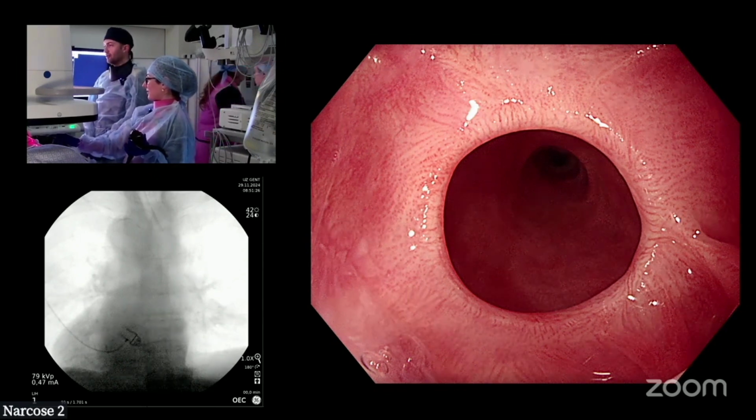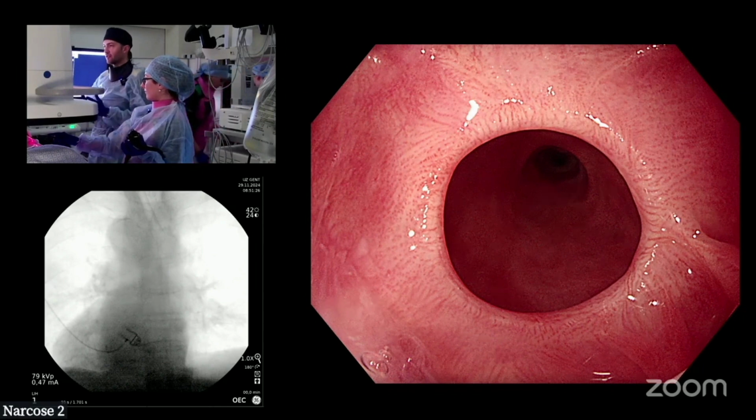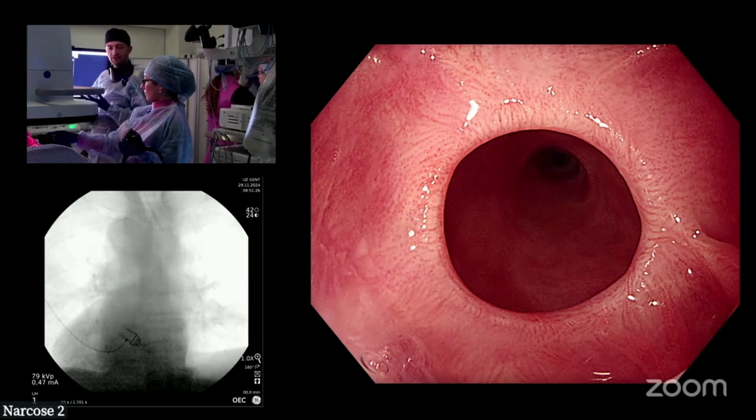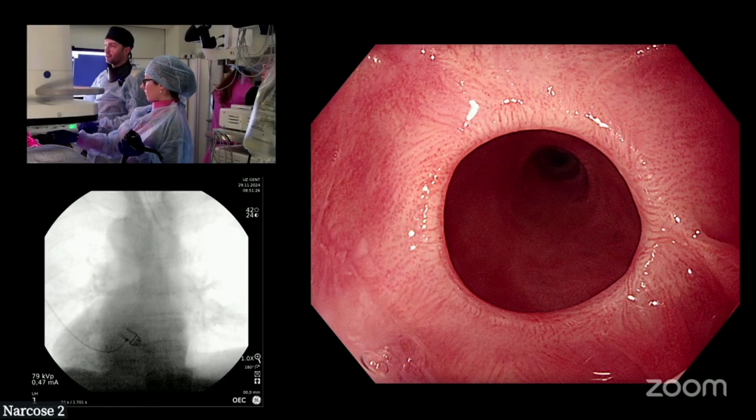So that's important. It starts with assessment of the stenosis. Can I assess it endoscopically? And in this case, you can assess it endoscopically. You can see through it. So therefore, I don't need a nasogastric scope. I don't need fluoroscopy. I can make a decision based on this one endoscopic image that you've frozen, which is fantastic that you did it. So based on this image, if we cannot pass here, what could we do to open this?